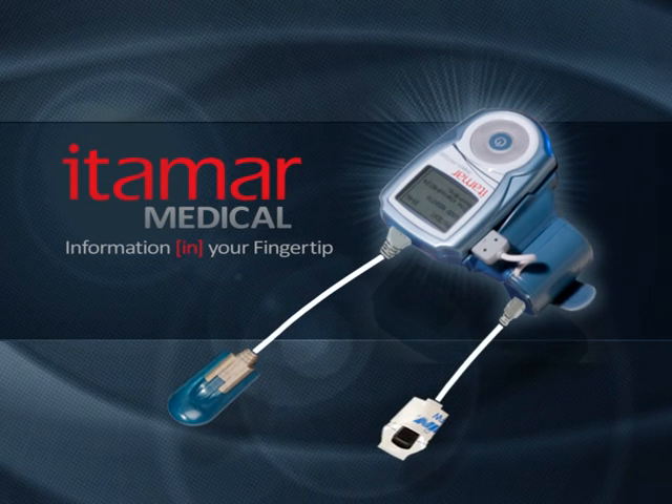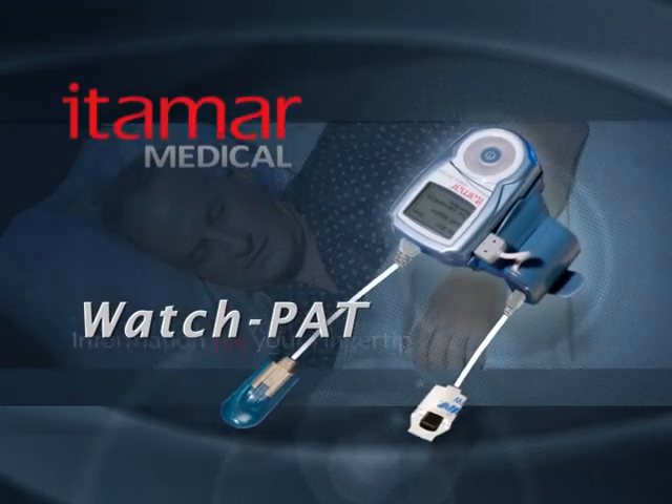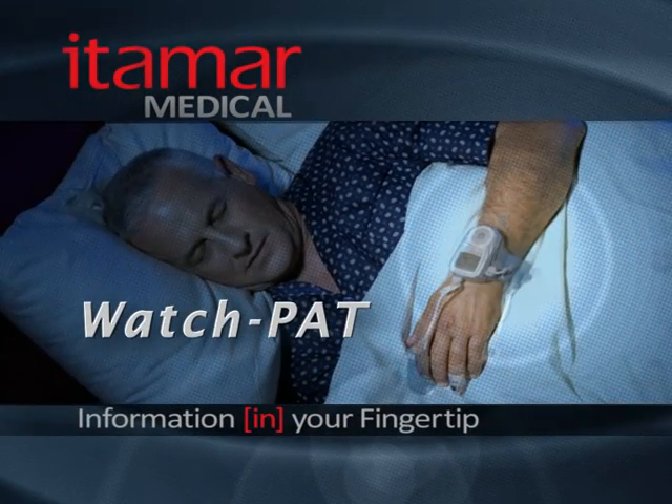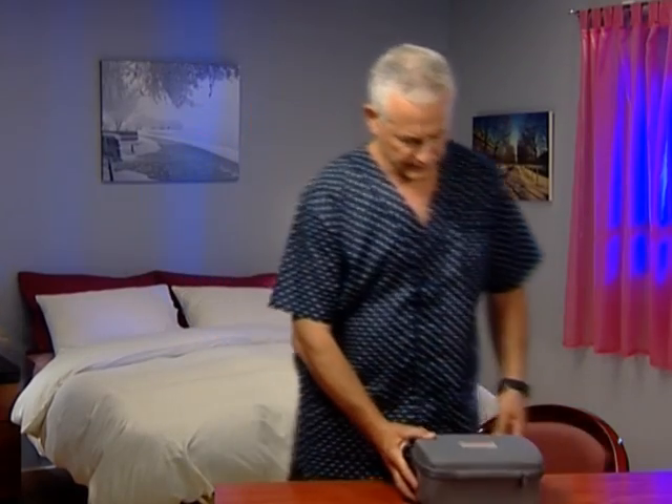This brief video will show you how to correctly put on and use the WatchPat sleep diagnostic device. You should put on the WatchPat when you're already in your pajamas, just before you're ready to go to sleep.